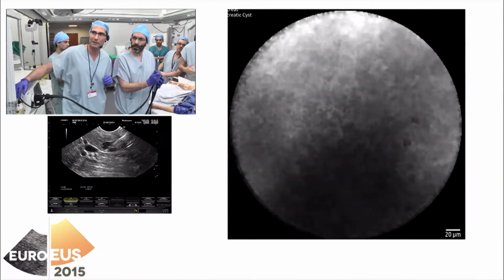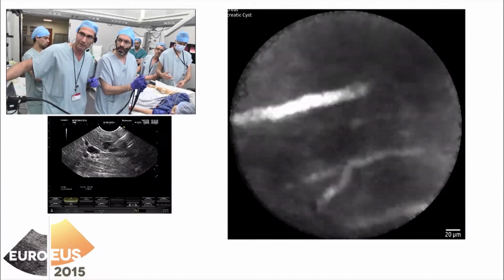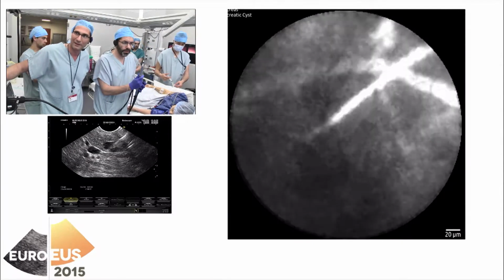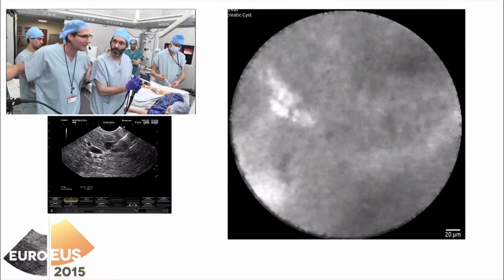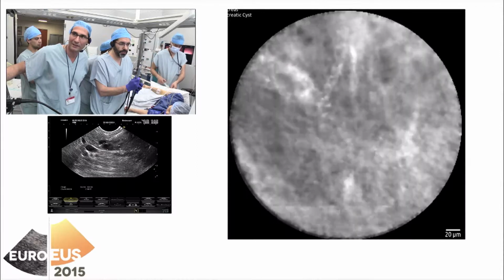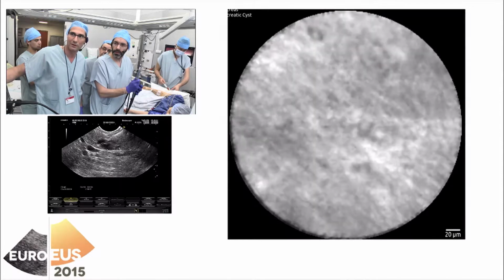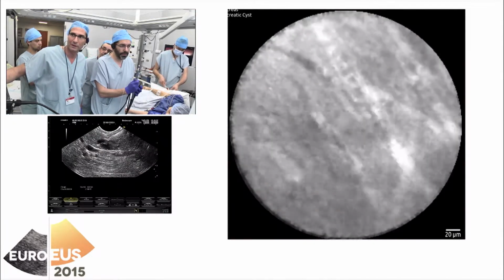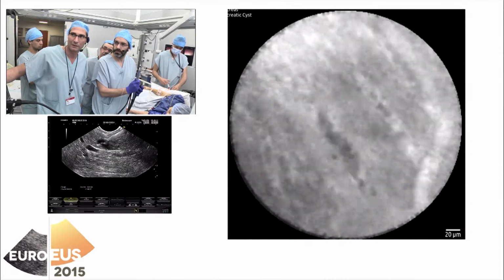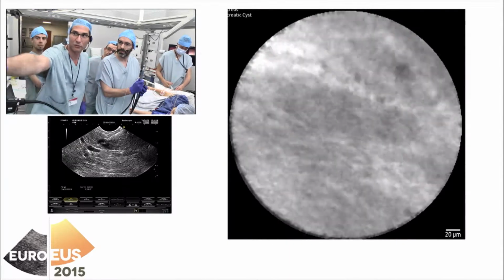No, I think, yes, I think it's pancreas. I'm trying to change. Yes, that's good. The flux has not all passed. No, we should wait. It's a serous. You should wait because of the fluorescence. Yes, now you see all the vessels.